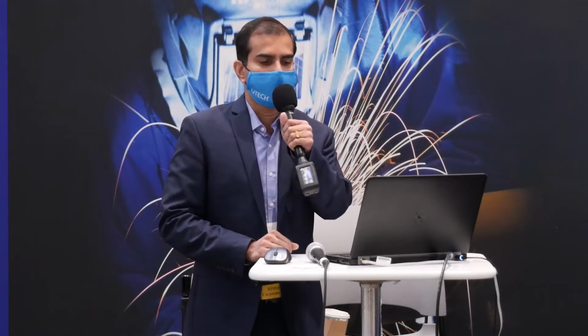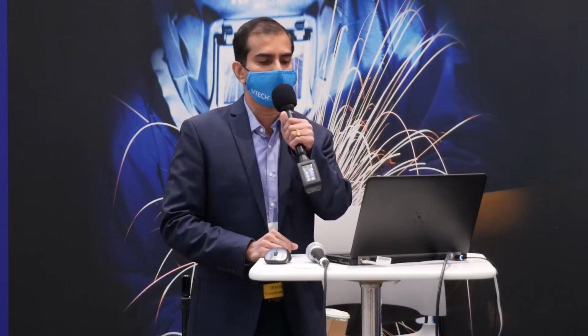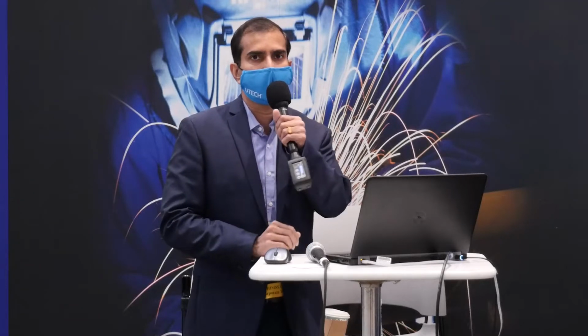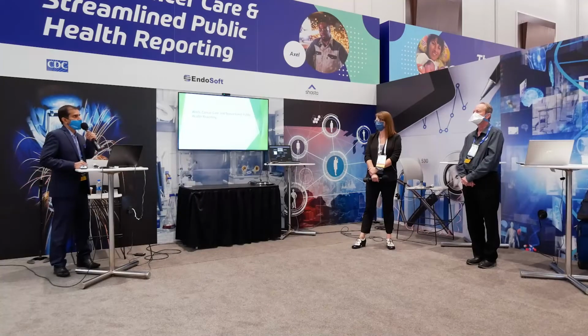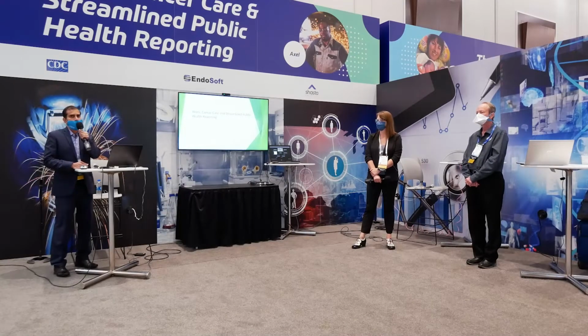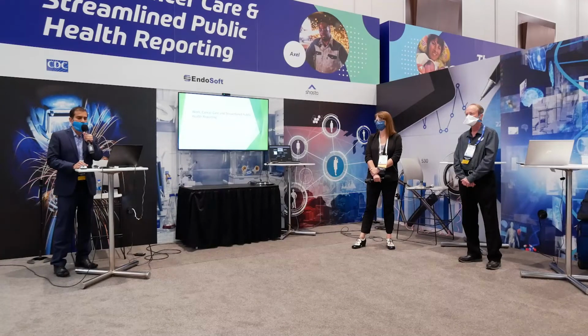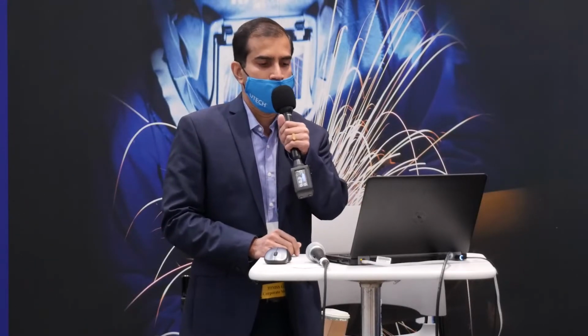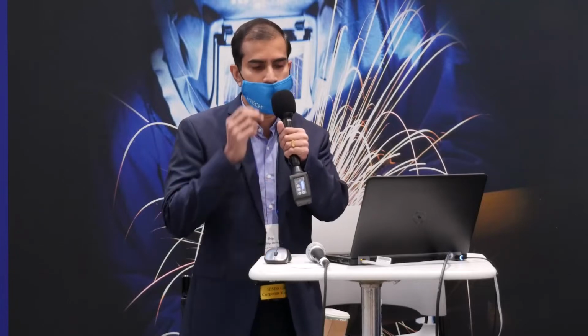Today in this use case, we are going to follow our patient, Axel, who's working with an oncologist to diagnose possible lung cancer. We also demonstrate how data interoperability works between different systems, such as EHR, pathology lab, backend services app, and state cancer registry using HL7 and FHIR standards to provide best patient care and also to create fast and complete reports to the public health agencies. And finally, we will conclude by showing how the FHIR standard can be used for death reporting.